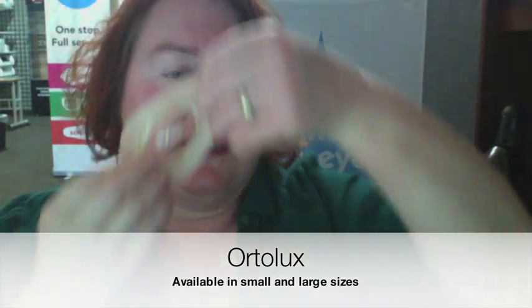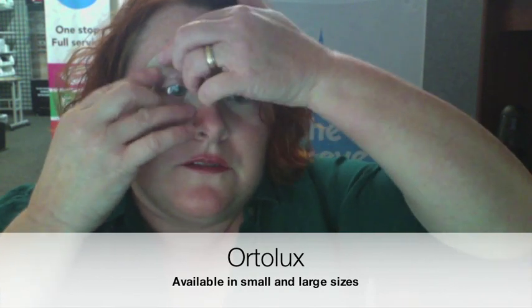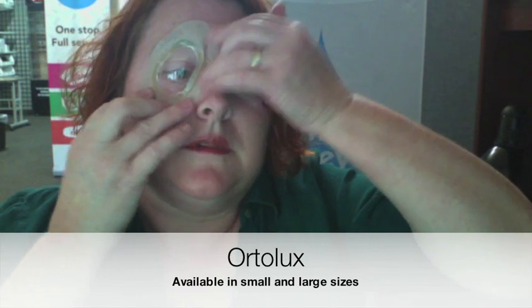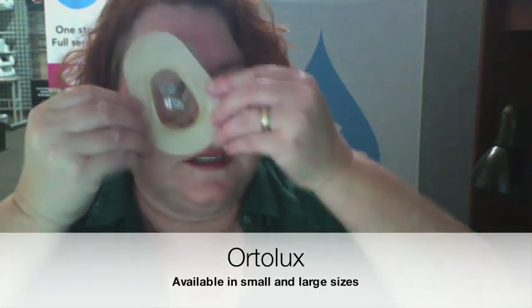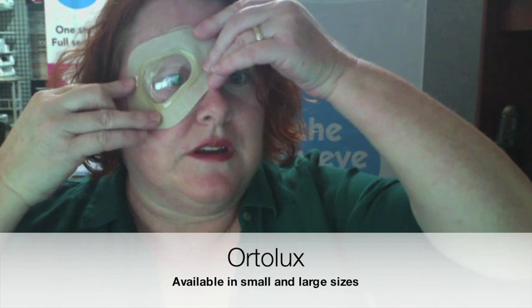The big difference with the Ortolux — and I'm just going to put the small one on — is the adhesive. It's stickier. It will much more easily stick to itself, by the way, because this thing is more like a band-aid, more flexible versus the Night Eye which is just a lot stiffer. So that's the small size, and then just for comparison, the large going over that.